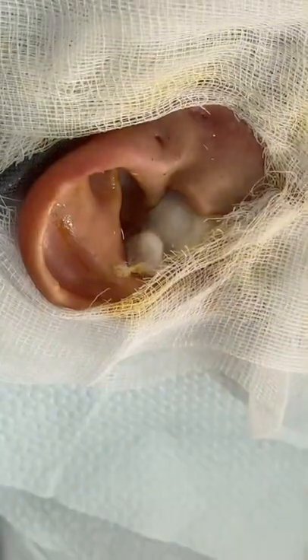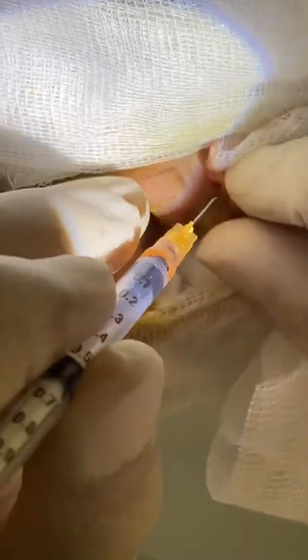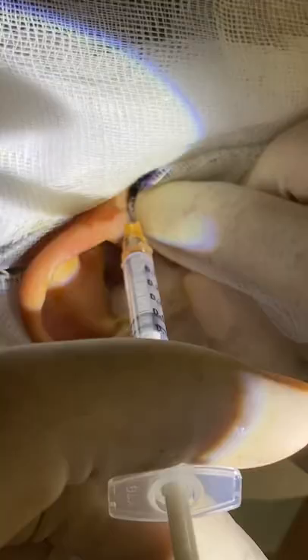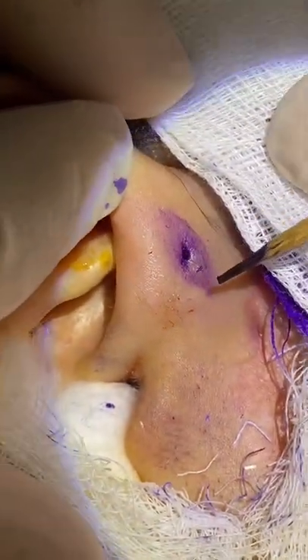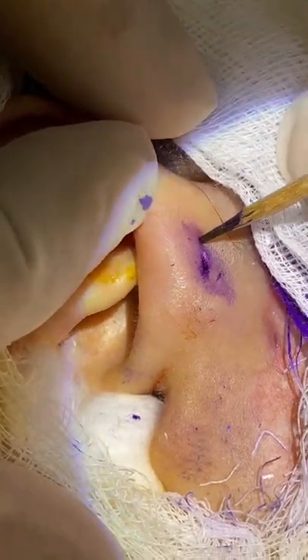We are going to inject a dye. In this case we are using gentian violet so that we can trace the tract. There you are — that's gentian violet. It leaves some stains. I have made a mark here with gentian violet, and this is the area where I will incise.